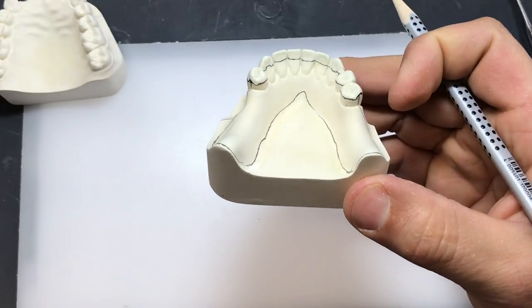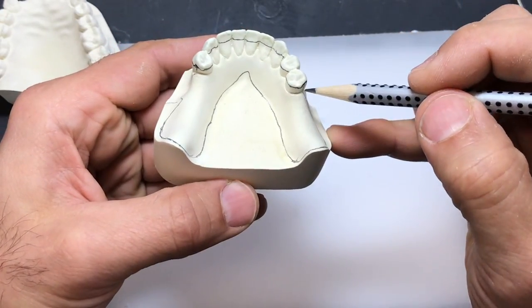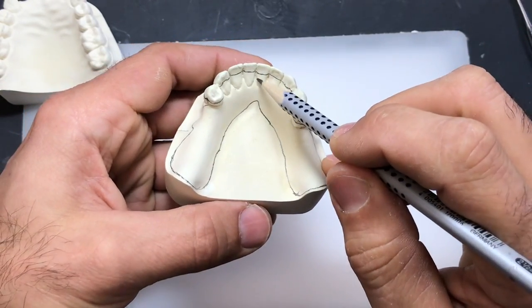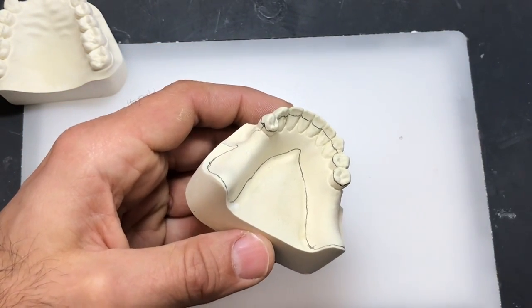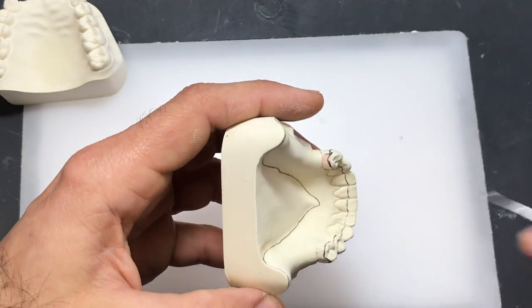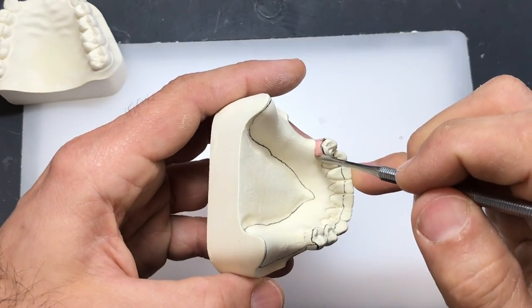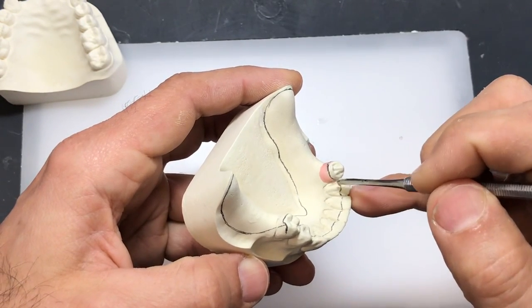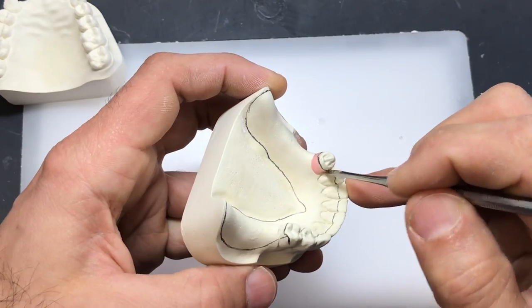Once we have that, we can start thinking about blocking out the undercuts on the lingual side of the posteriors, on the distal guide plane, on the 3-4 and the 4-5. We're going to incorporate some wax inside the gingival margins here as well. I'm going to use my number 7 spatula — I like to use the tip of it just to have a little more control of the wax — and basically I'm blocking out the undesirable undercuts.